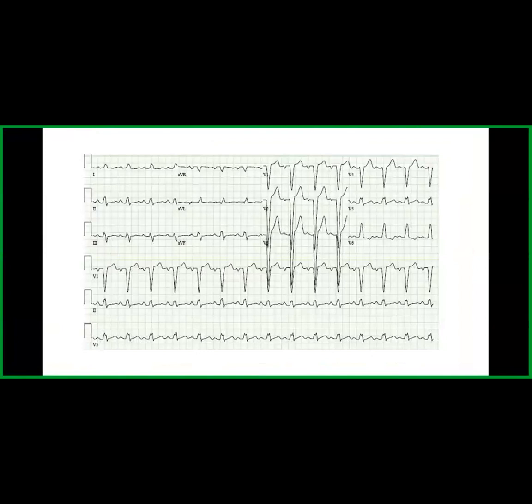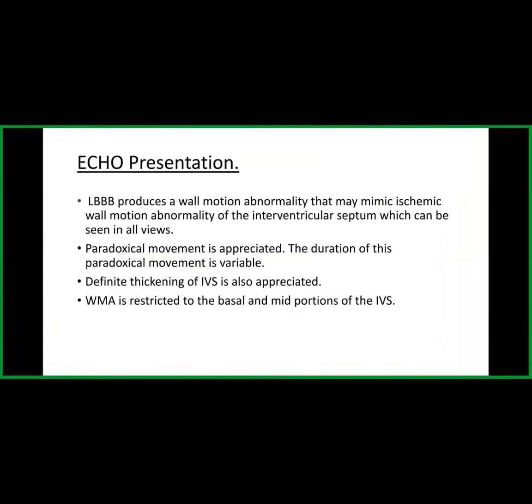Okay, so now that we have all heard about what exactly a left bundle branch block will look like on an ECG, we will move on to look at how exactly it presents itself when we are looking at the echocardiography.